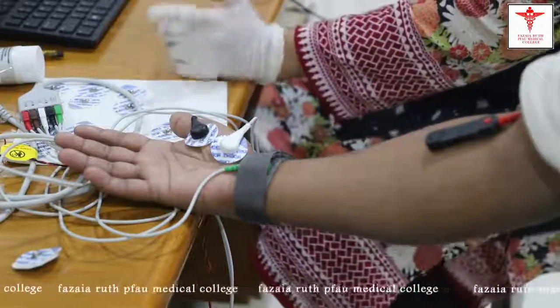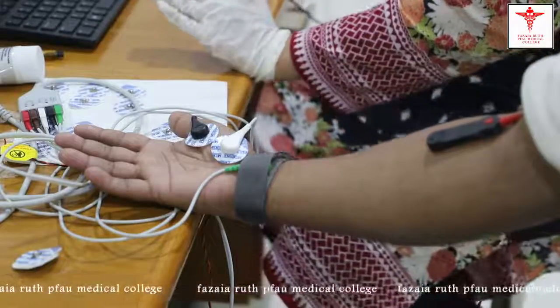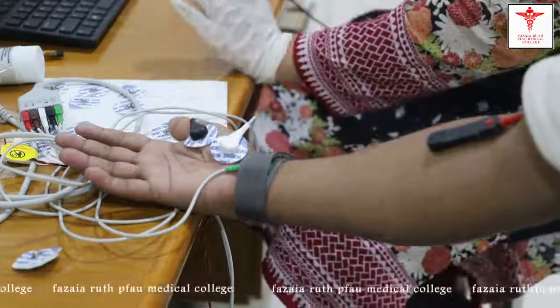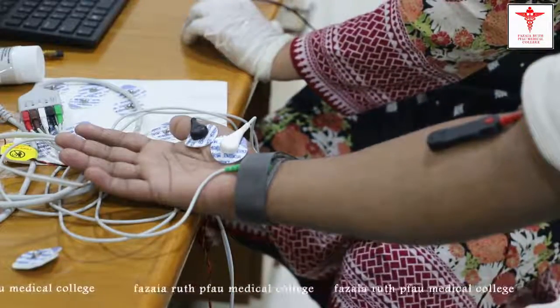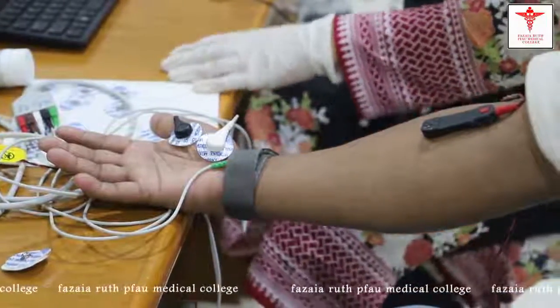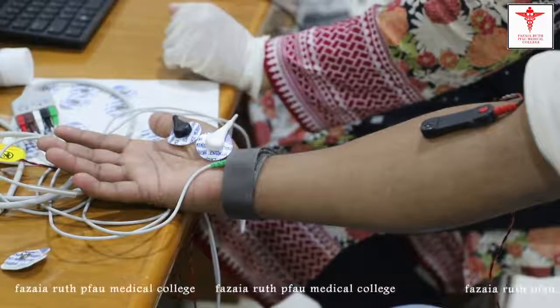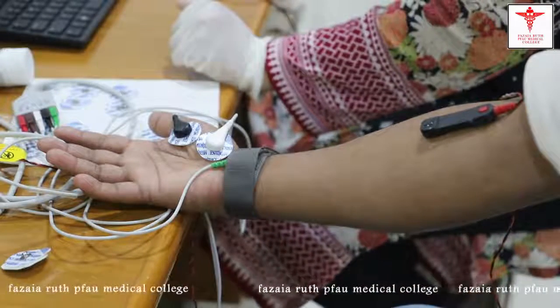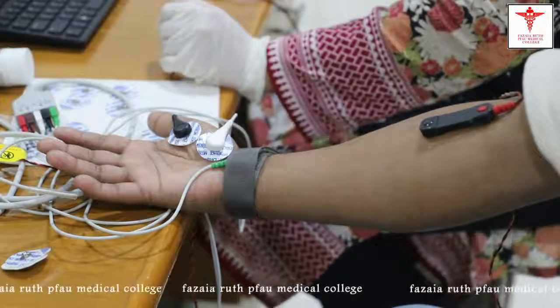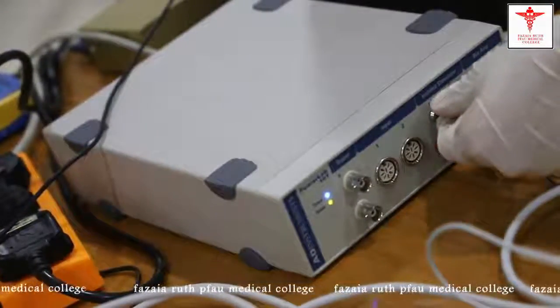Now we will set the current in the stimulator panel to 8 milliamperes and then click start. We will do this procedure several times using low amplitude pulses to help find the best position of the electrode. Once you have found the best position for the bar stimulus electrode, increase the stimulus to 15 to 20 milliamperes. Click start and repeat the procedure several times. Then turn off the stimulator switch.